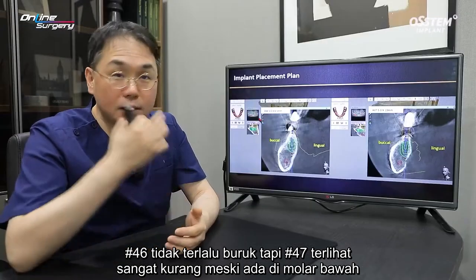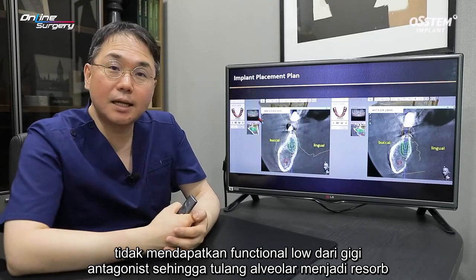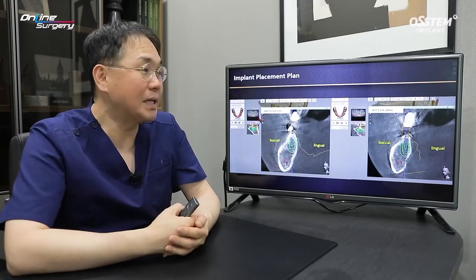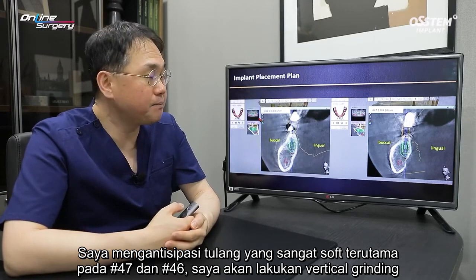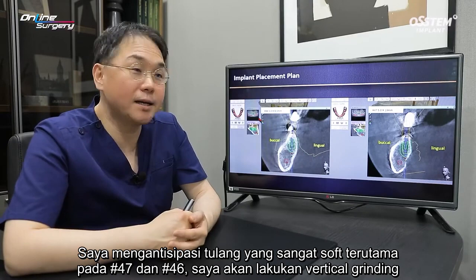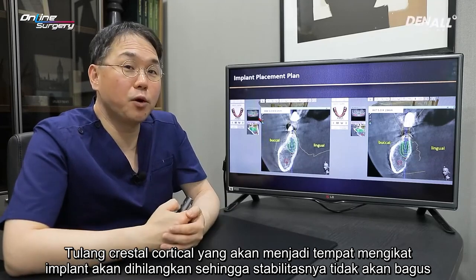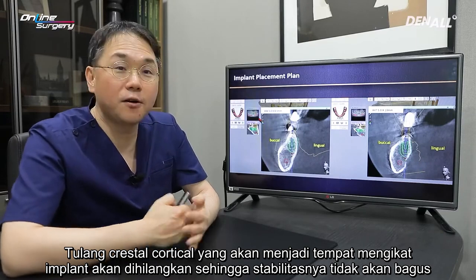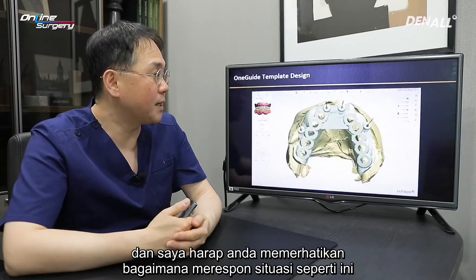Even if it's a lower molar, if it does not get functional load from the antagonist, the alveolar bone as well as the trabecular bone becomes resorbed. I anticipate very soft bone, especially in the case of number 47 and 46. I'm going to do vertical grinding. Crestocortical bone, which the implant engages, is going to be lost completely, and therefore stability is not going to be good. And I hope you take note of how to respond to these situations.